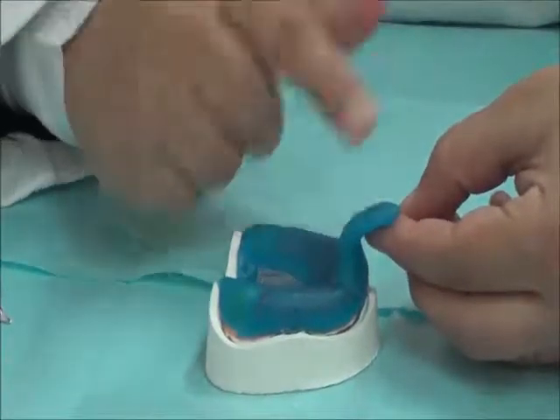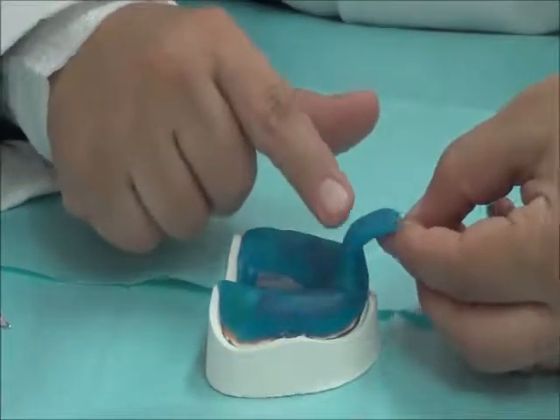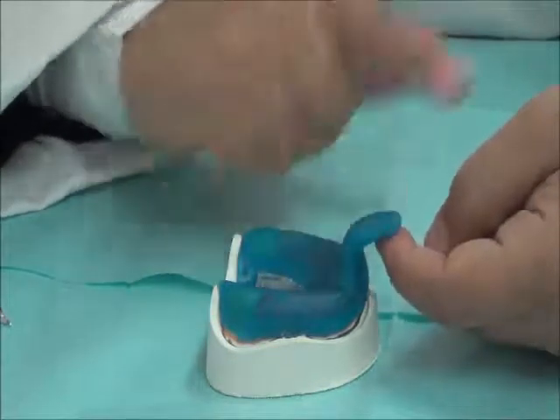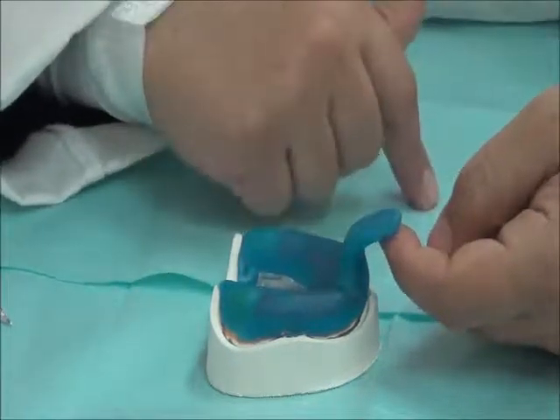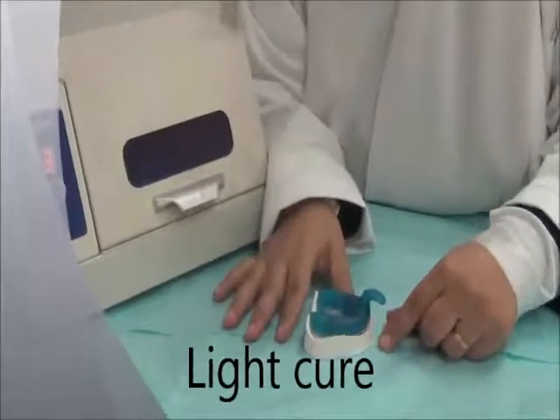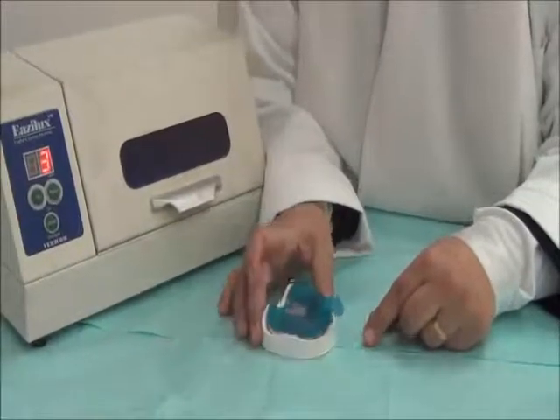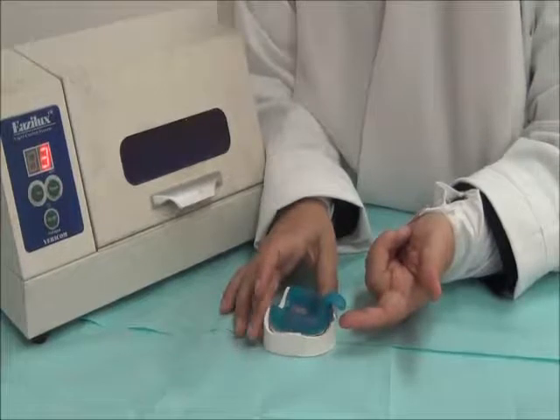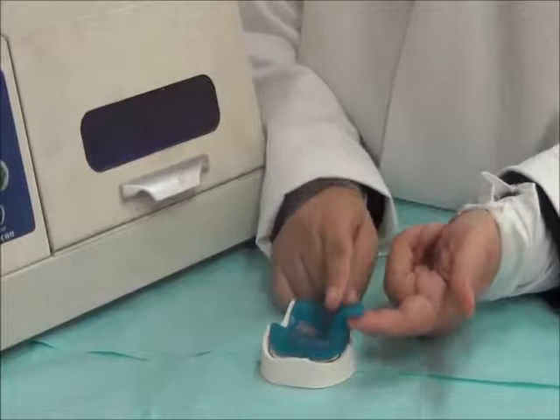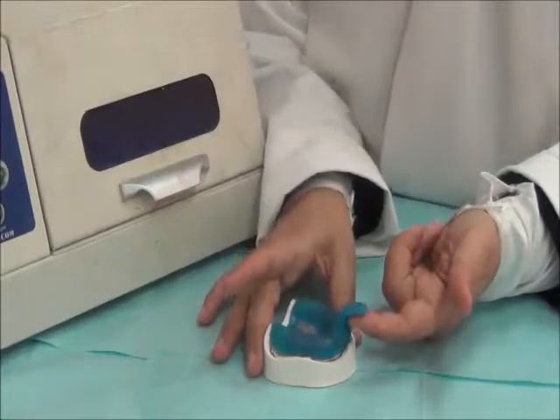But keep in mind that sometimes the light cure material you're using might flow back down, so we might need some support here inside the light cure. So now we're ready for the light cure. What we said about the handle: sometimes it slumps down, so we need to put it back, and when we put it in the light cure, we're going to support it with something.